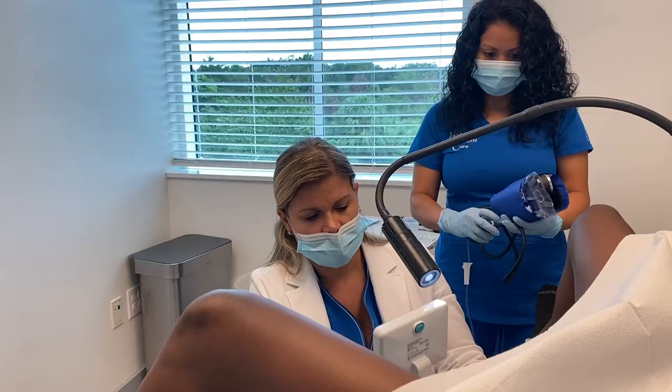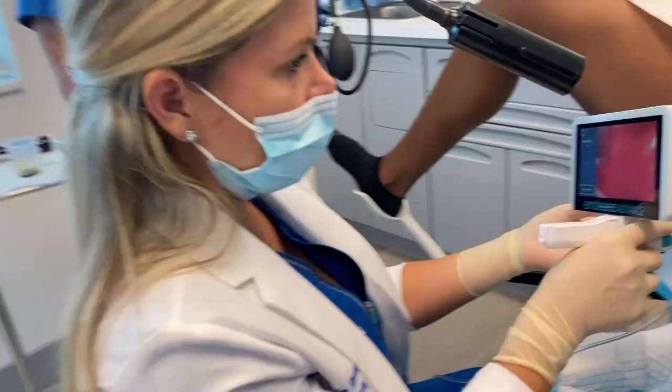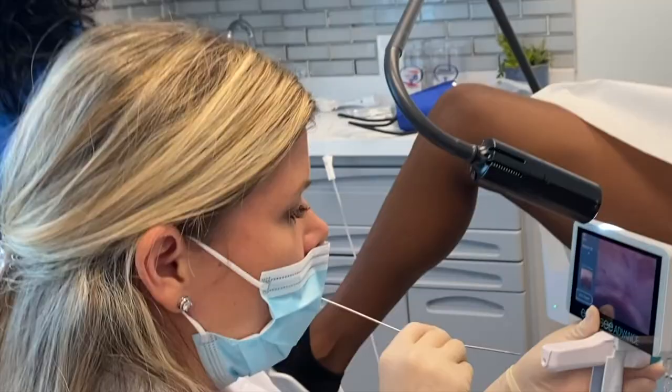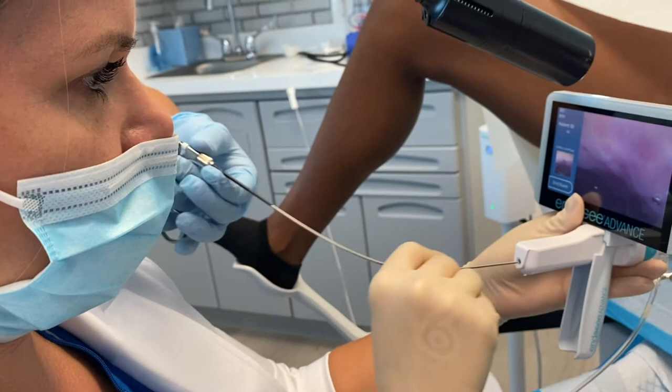So right now, I'm inside the womb. You see the IUD is in there. And you can tell that it's tilted sideways. So what I need to do is pass a little clamp. And we're gonna be removing it right now. We thread the device all the way in.